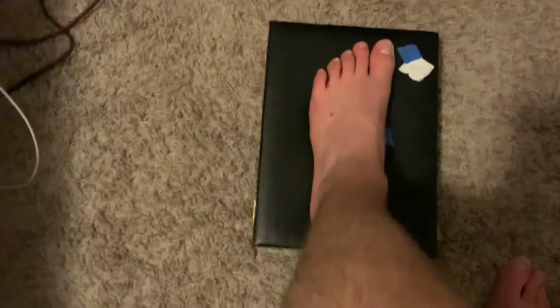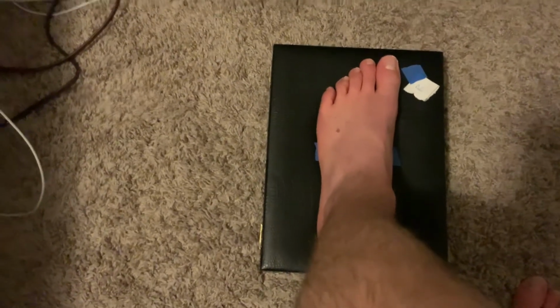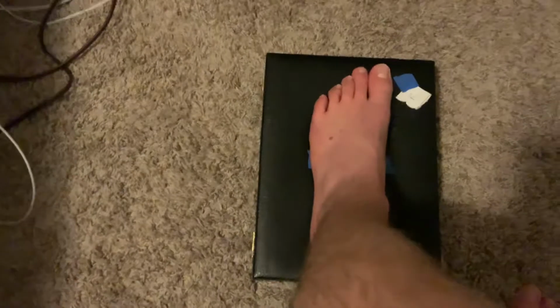Moving on to the foot, A to P foot. So the plantar surface of the foot will be resting on the cassette. Our central ray will be directed through the midpoint of the foot at the base of the metatarsals. And it will be collimated to include the phalanges, the metatarsals, the cuneiforms, the cuboid, and the navicular.